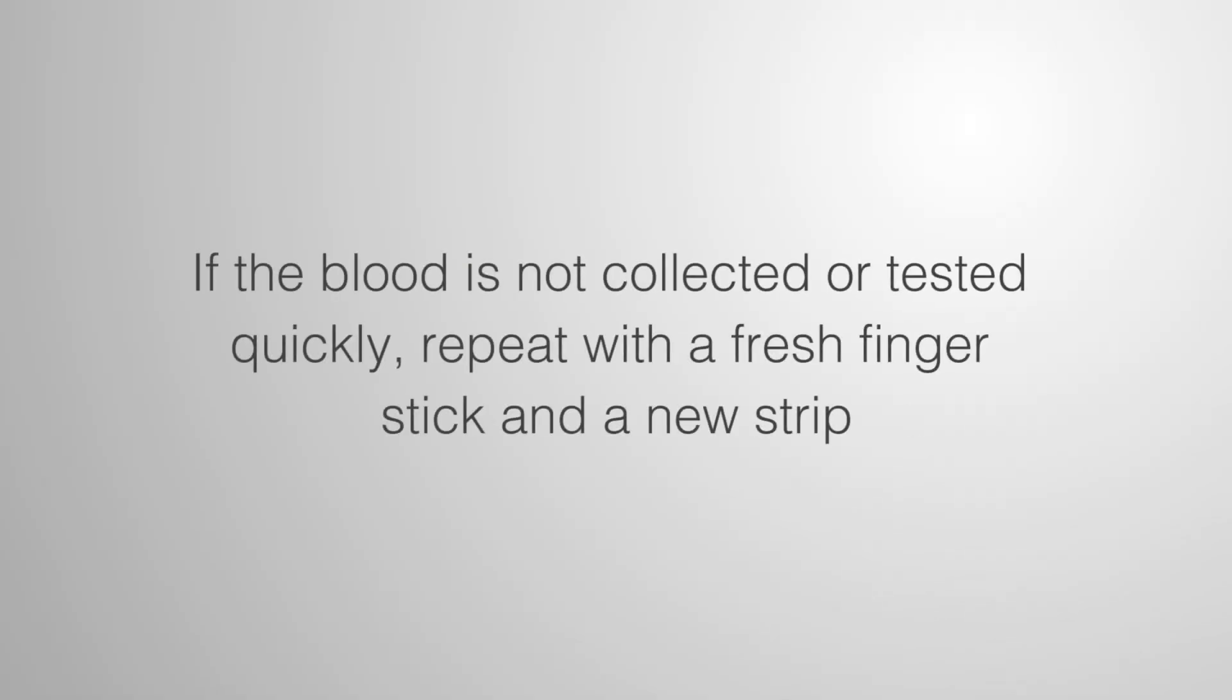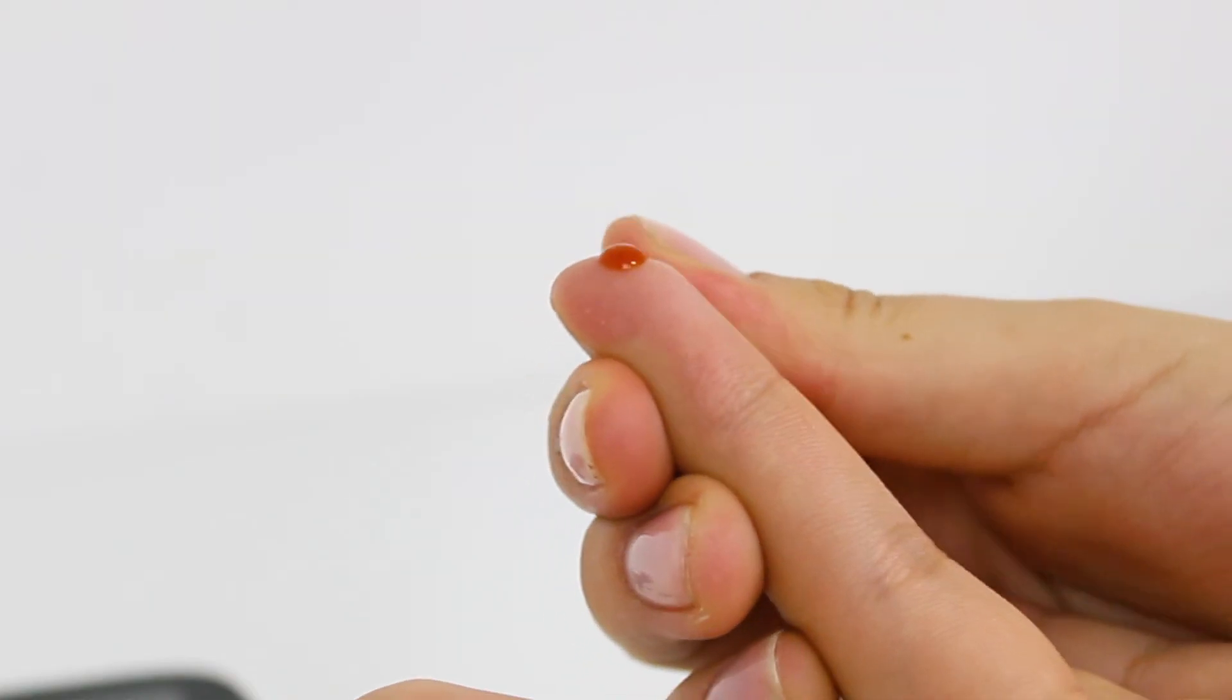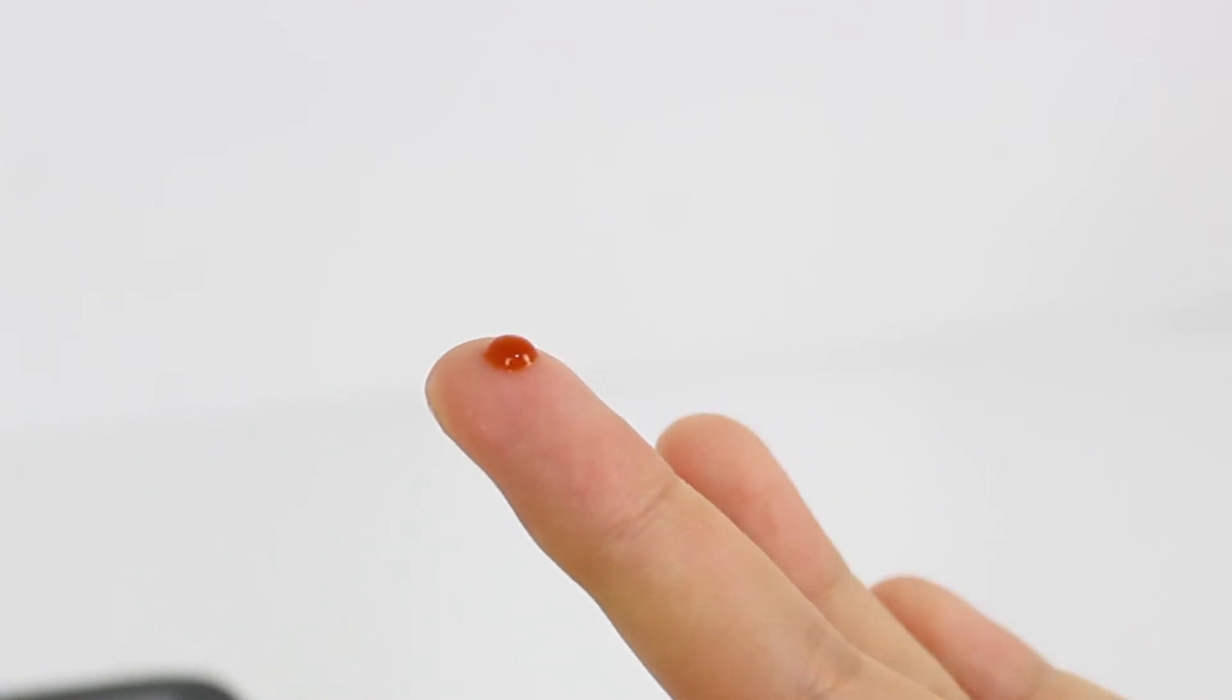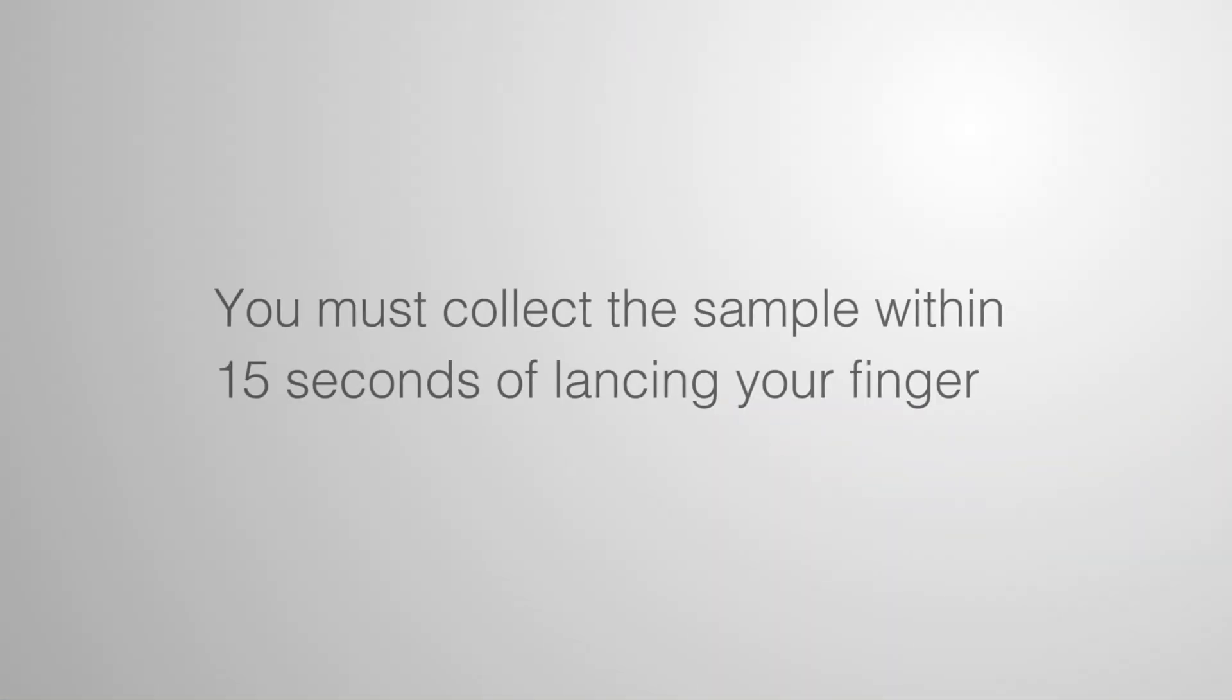If the blood is not collected or tested quickly, repeat with a fresh finger stick and a new strip. Keep gently squeezing the finger until you produce a pea-sized bead of blood. You must collect the sample within 15 seconds of lancing your finger.